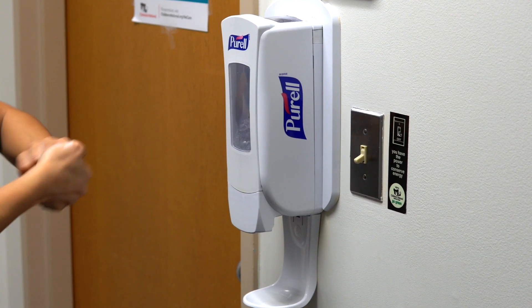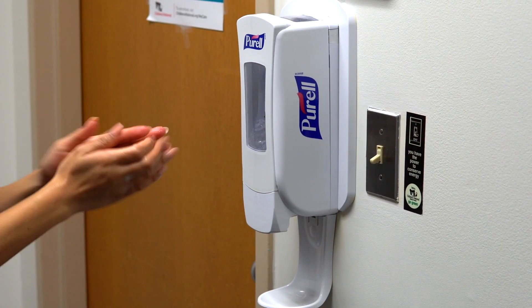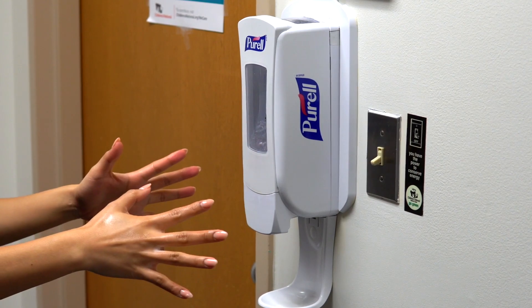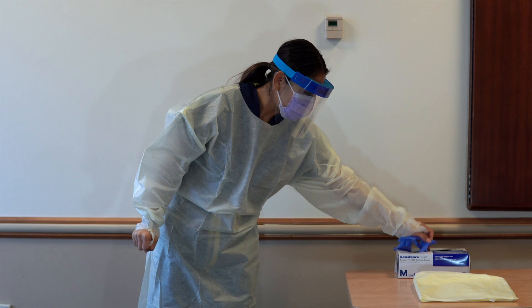And under fingernails. For hand washing, the entire process takes 40 to 60 seconds. For sanitizing, the entire process takes 20 to 30 seconds.